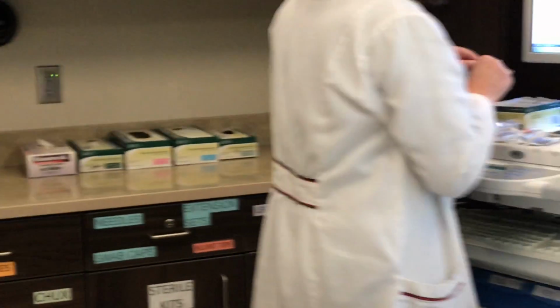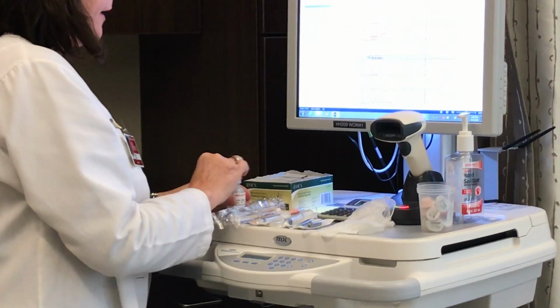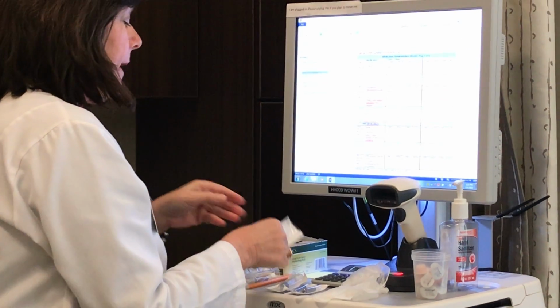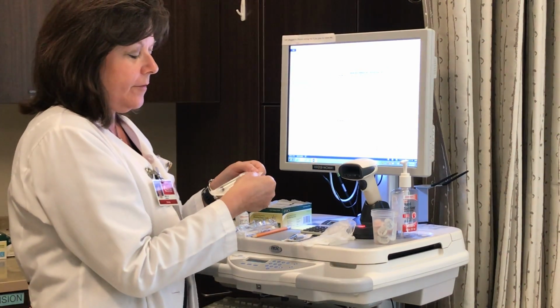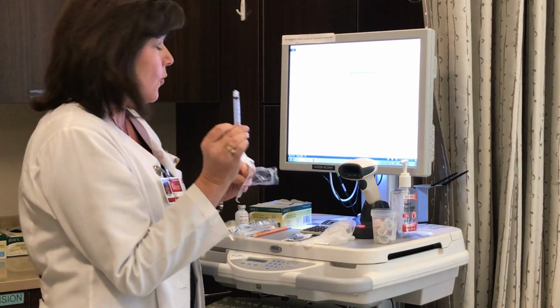Prepare medication maintaining aseptic technique. I'll be cleansing the top of the vial 15 to 30 seconds depending on hospital protocol and letting that dry. Since the amount of fluid that I need is 1.6 mLs, I'll be using the 3 ml syringe. I've checked out the increments on the syringe and each line is worth 0.1 ml.